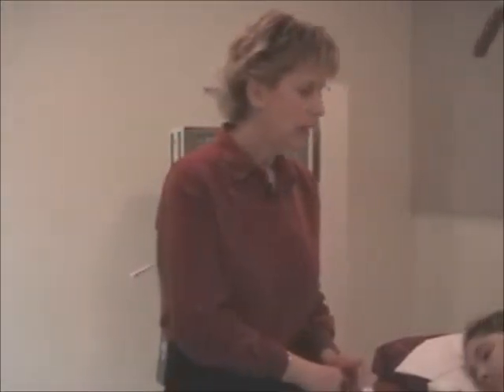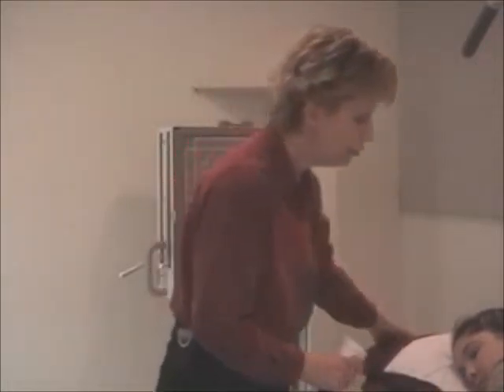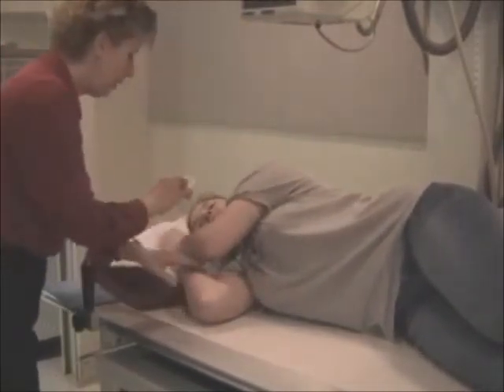Again, the positioning, RAO is a very common oblique for esophagus, usually 30 to 45 degree obliquity. Another common position that might be used for an esophagus is a lateral position. And you might do a left lateral or you might do a right lateral. For the sake of demonstrating here in the camera angle, we're going to turn our patient into a right lateral mode. Oh, there you go. And patient can face the camera. Get them comfortable in a true lateral position. Arms forward. And then they're going to hold the cup again.